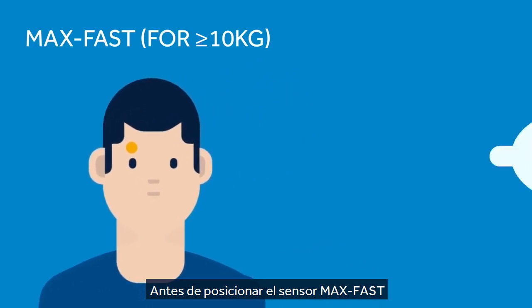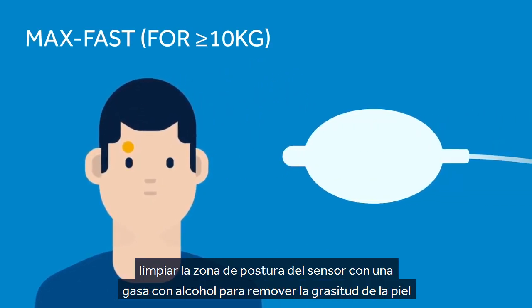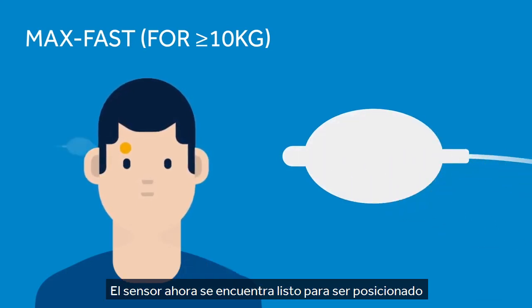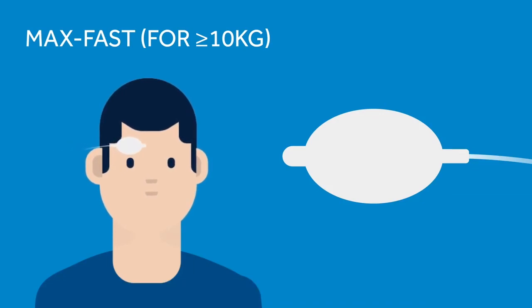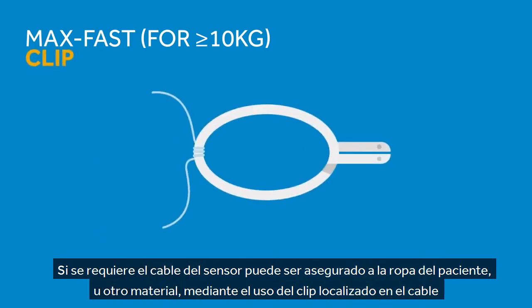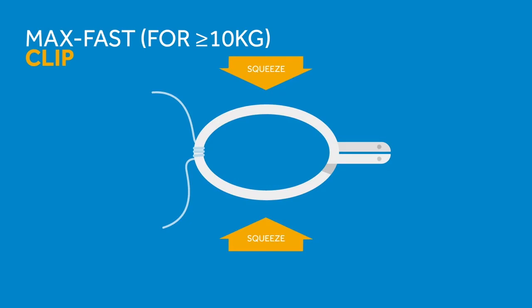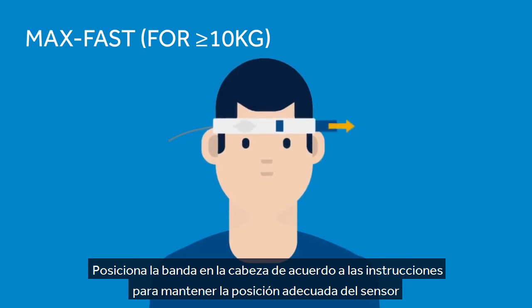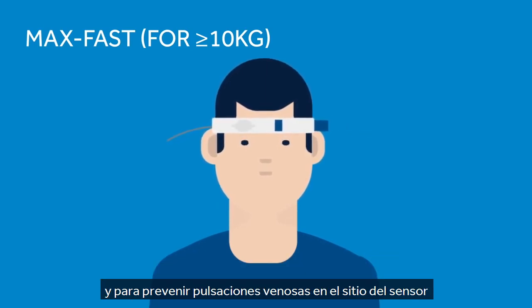Before applying the MaxFast, clean the sensor site with an alcohol wipe to remove skin oils, then remove the paper backing to expose the first of 4 adhesive layers. The sensor is now ready to apply. If required, the sensor cable can be secured to the patient's clothing or other material by using the clip located in the cable. Apply the headband per instructions to maintain proper sensor position and to help prevent venous pulsation at the sensor site.